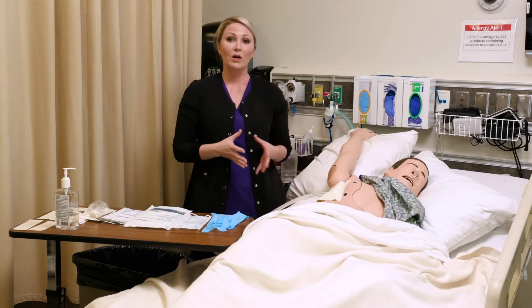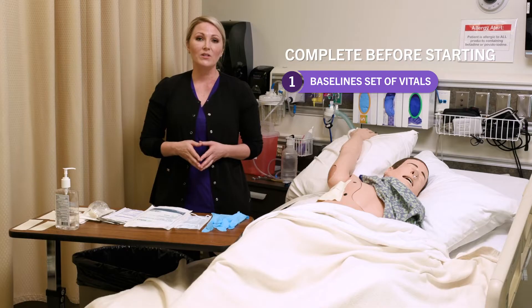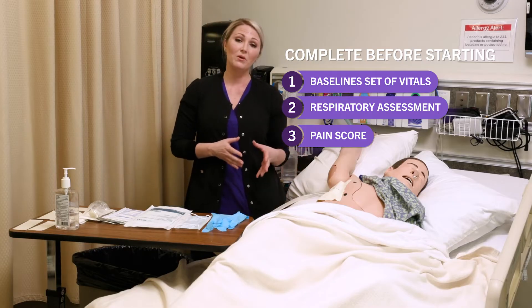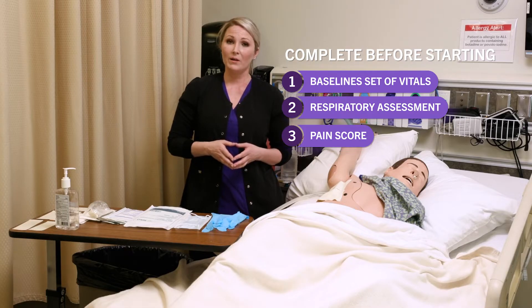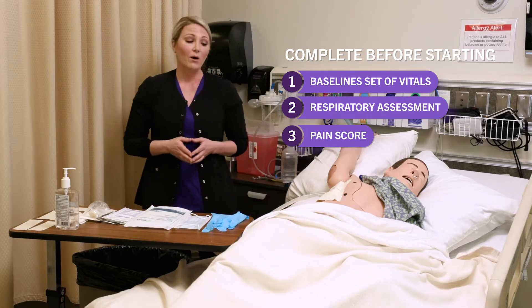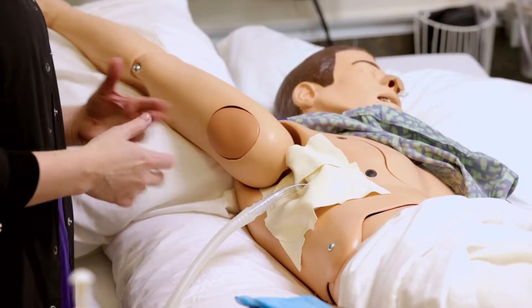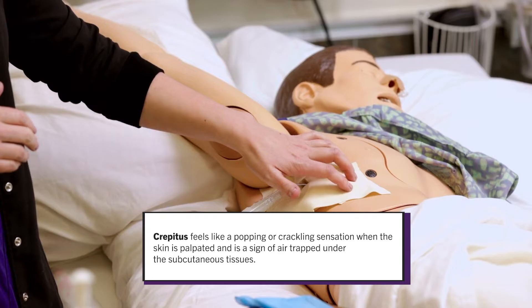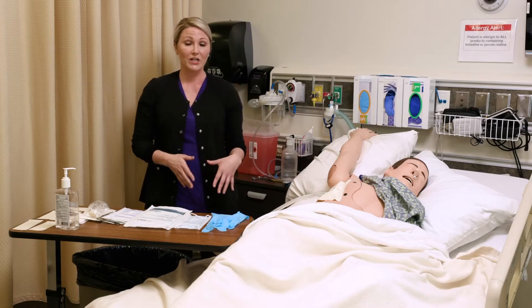Now that we've completed our patient education and prepped our patient for the procedure, we're going to complete a few things before we get started. First we want to get a baseline set of vitals. We also want to perform a respiratory assessment and then get a pain score. This procedure can be uncomfortable — we will do our best to make it as pain-free as possible, but we need that baseline score and to administer pain medications if appropriate. I'm also going to look at the dressing already in place: is it intact, is there drainage present, is it occlusive over the site? And I'm also going to be checking for crepitus — that's when we have air or gas trapped under the skin around the insertion site. I'm also going to be checking my chest tube drainage system.